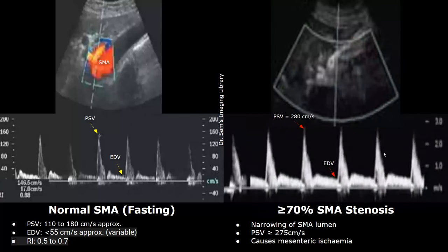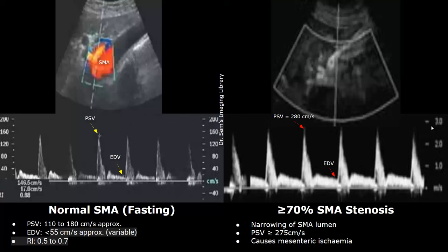Significant SMA stenosis can be detected on Doppler ultrasound. Stenosis is the narrowing of the lumen of the artery, usually due to atherosclerosis. A greater than 70 percent stenosis will have a PSV of greater than or equal to 275 centimeters per second. In this image, the PSV was 280 centimeters per second, which is greater than 275 — confirming stenosis greater than 70 percent.